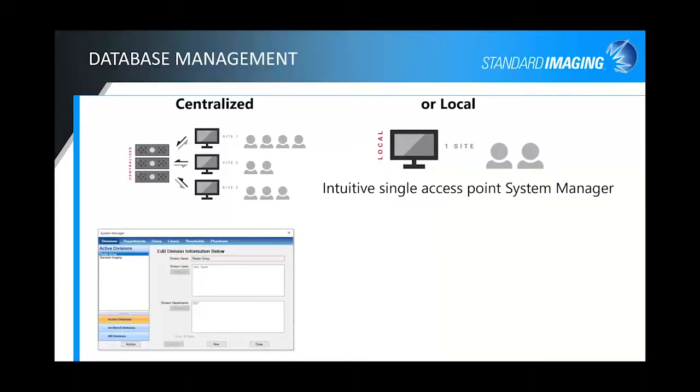So one thing about the PIPSpro software is that it's designed to be suitable for just about any size of facility out there, from your single LINAC small facility to very large enterprise-wide systems that have numerous sites overseen by one centralized company, corporation, or group, as it were. So, like I said, it's scalable for enterprise or for single facility.